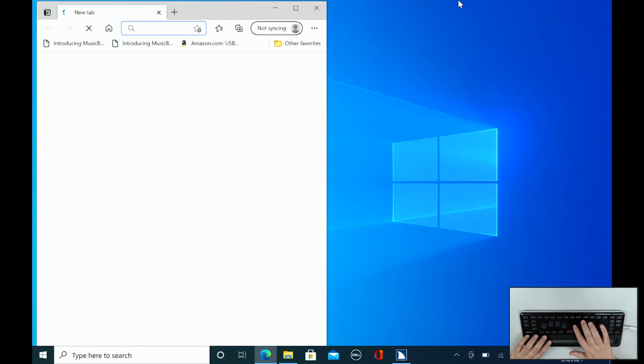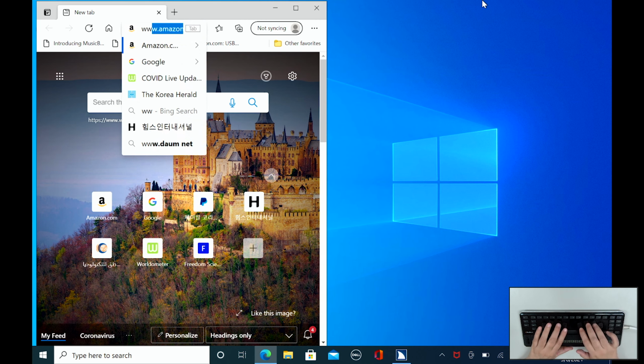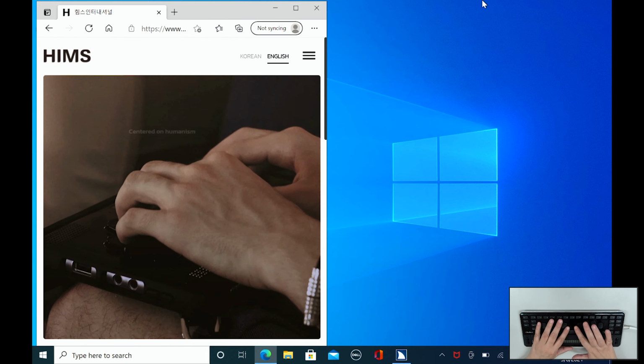Enter. Selected. About. Blank. App bar toolbar. Address and search bar edit. Search or enter web address. So we're actually going to visit our website, and we'll look for the information on our QBraille. So I will type the address, www.imsint.com, and I've been there before. Enter.